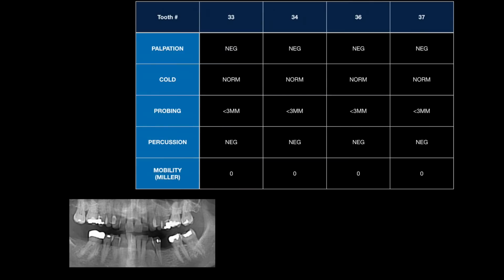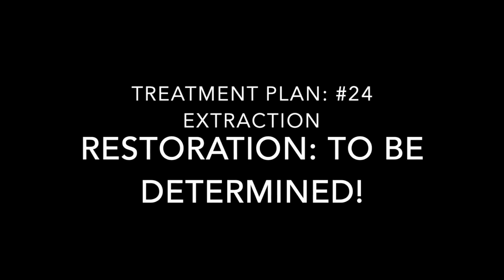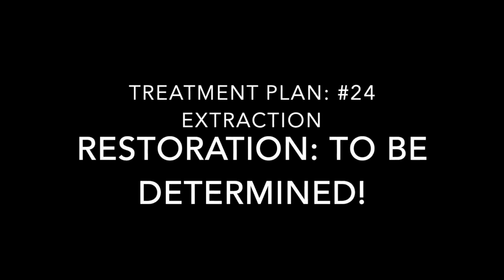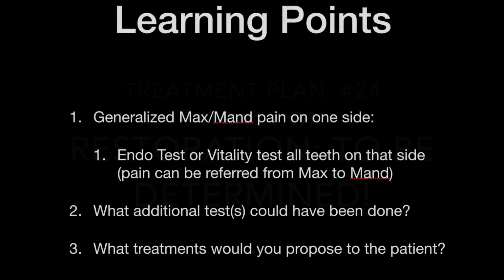Now here is sensibility testing for the mandibular left arch. It turns up normal. So my diagnosis for this tooth was tooth number 24 necrotic with asymptomatic apical periodontitis. It is a cracked tooth or split tooth. I don't have an image, but there's a split right down mesial to distal on that tooth.